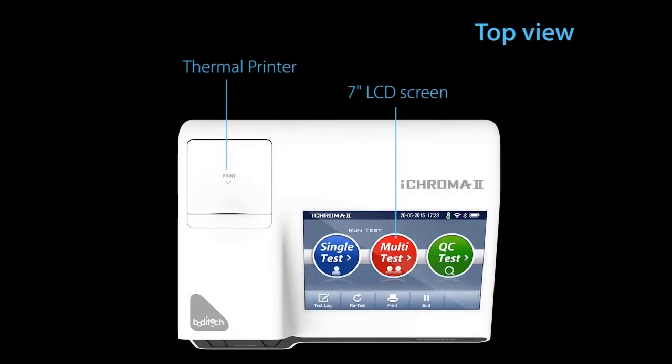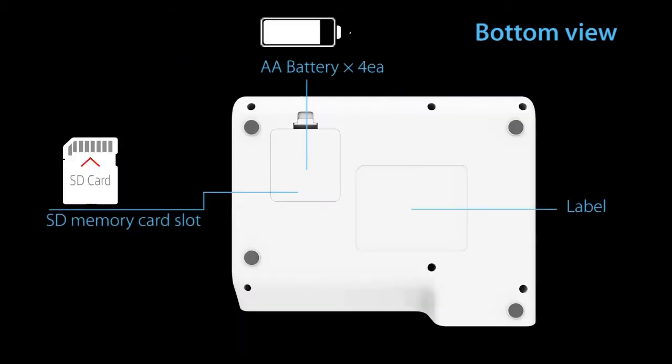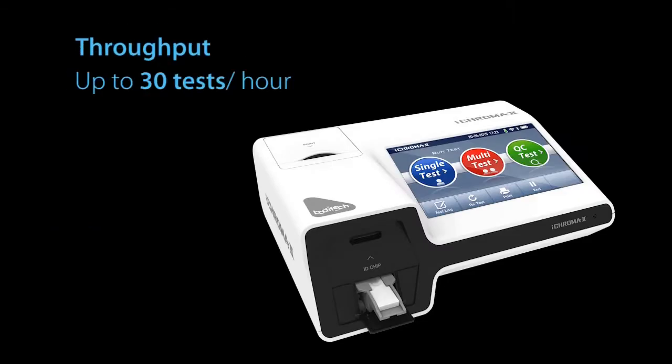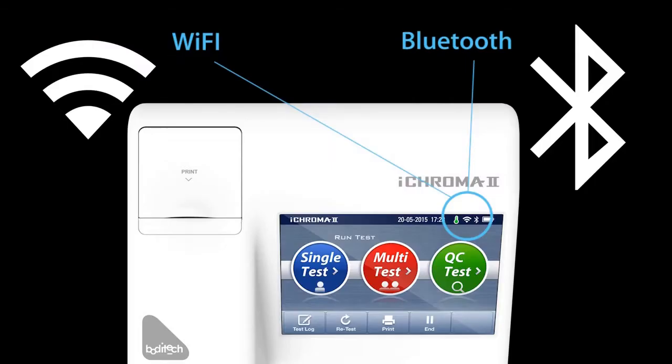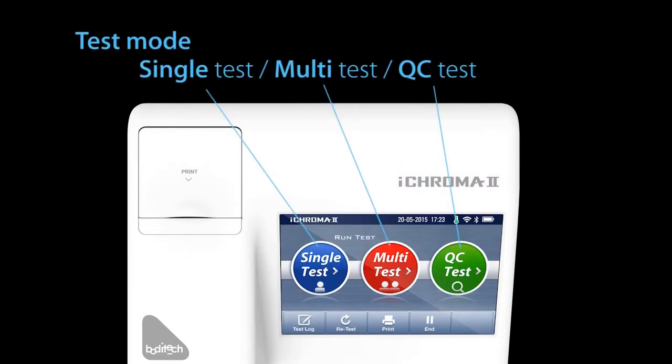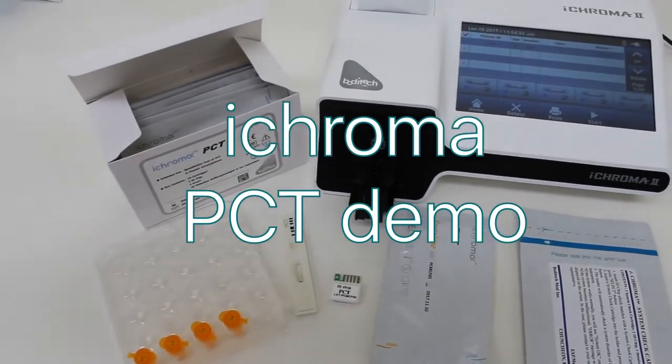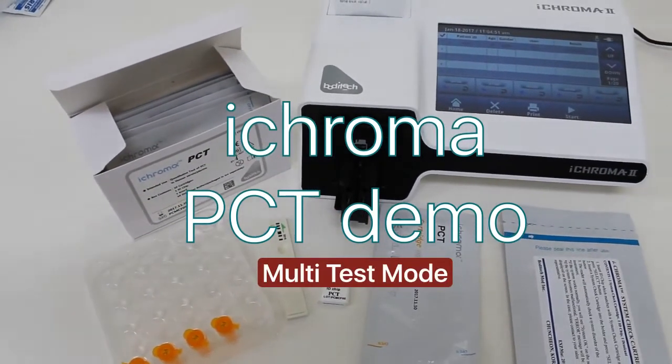iChroma II can be used for screening, monitoring, and routine physical examination in laboratories, hospitals, and physician clinics. The reader comes with three different test modes, used depending on user preference, volume of tests, and sample time. In this video demo, we will be testing the level of PCT in a human sample in multi-test mode.